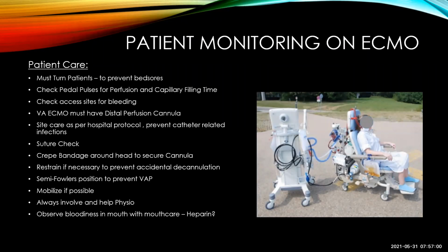Just basic patient care. You have to turn the patients to prevent bed sores. You must check the pedal pulses for perfusion and capillary filling time. Check the access sites for bleeding, especially in the groin area. You can easily have a hematoma in the groin area, so check that. And if it's necessary, change the sites and put pressure on there.